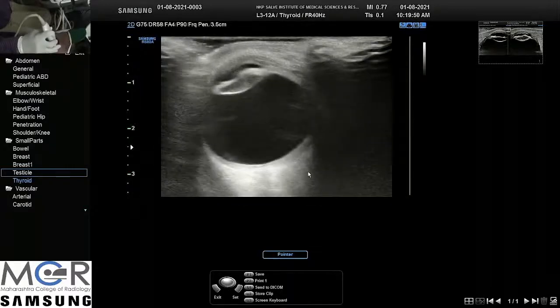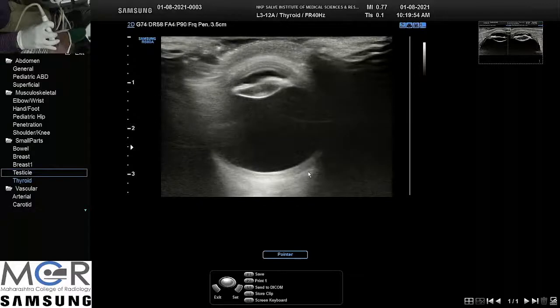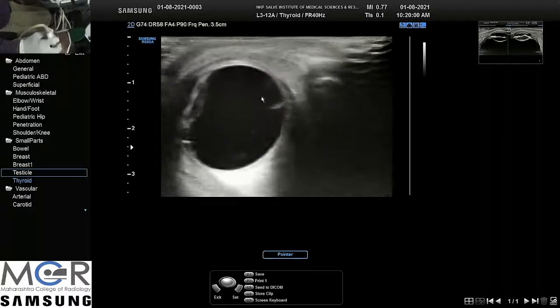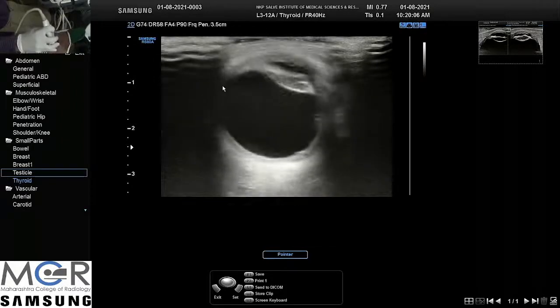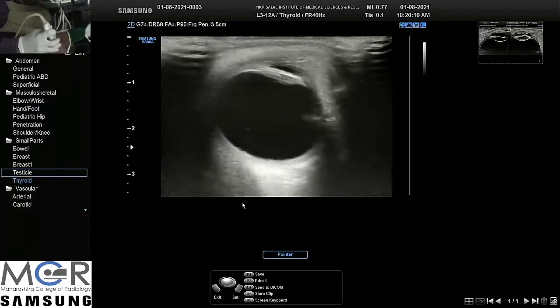So we have to localize the foreign body, and try to see whether there is any foreign body in the vitreous, posterior vitreous or the extraocular compartment. So obviously there is no foreign body on this side. Turn your eye outward. On this side also there is no foreign body.